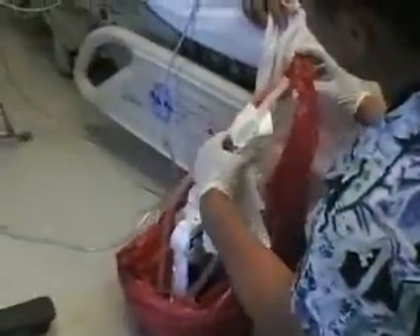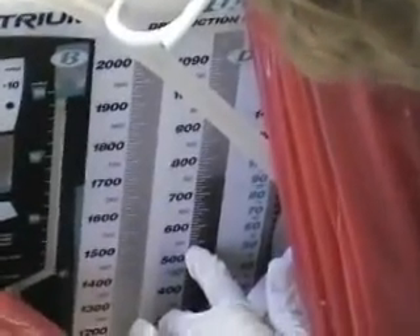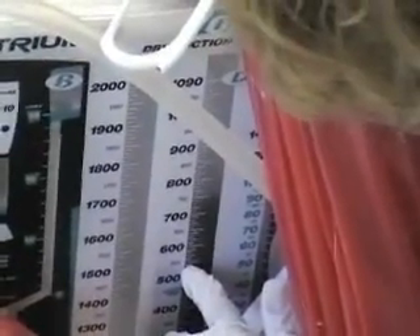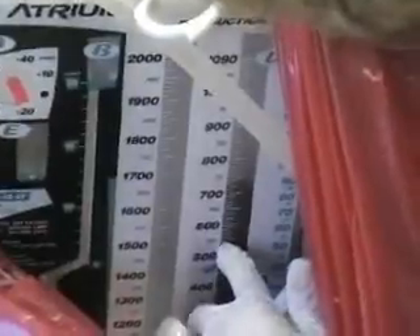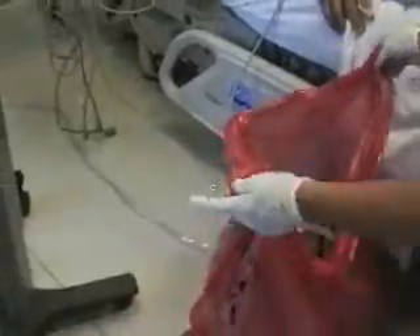She'll measure for the last time what was the total, and she already did that. And you mark that here every hour as you go — like 730, 460 — and right now it's 540. And every hour you keep an eye on it as it increases. Any more than like a hundred an hour, you need to let the doctor know.